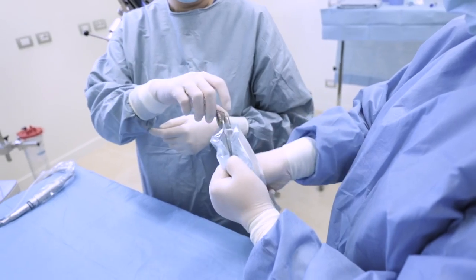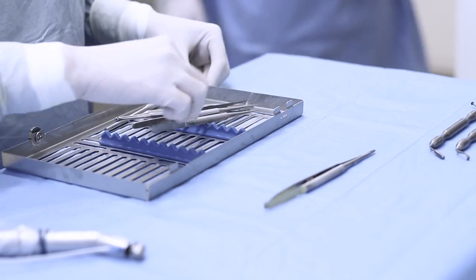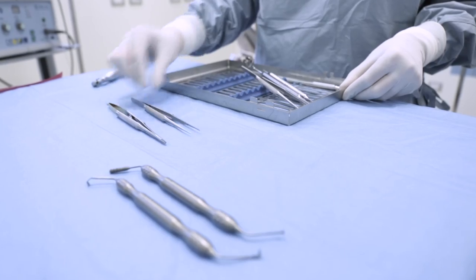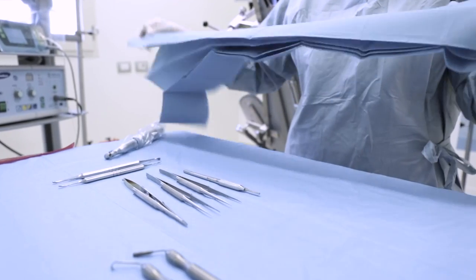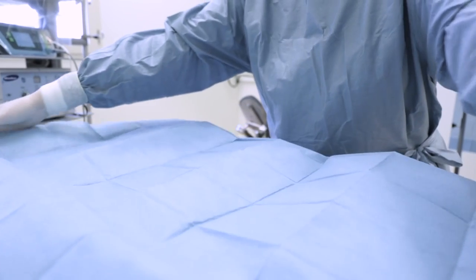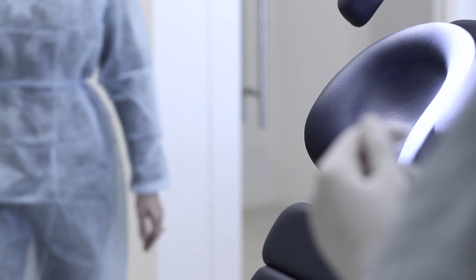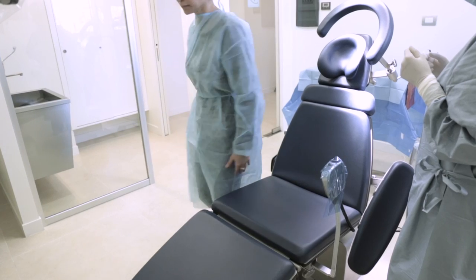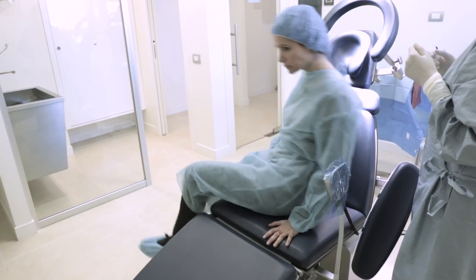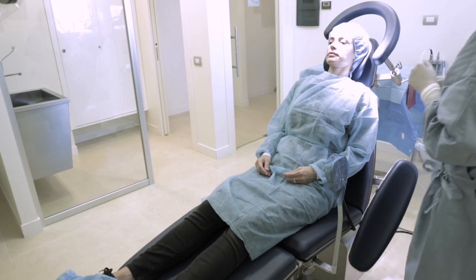Once all operating room surfaces have been isolated, the non-sterile assistant helps prepare instruments required for the operation. Instruments are then covered by a sterile cloth to preserve sterility. Once the operating room is ready, the patient enters wearing a visitor gown to contain residual bacterial load on clothing and a transparent cap to contain hair.